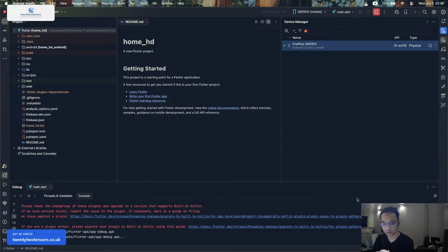Like I have my old system before that has an AI connected with a knowledge base and can collect the latest blood test result, analyze the blood test result, and analyze the treatment efficiency.